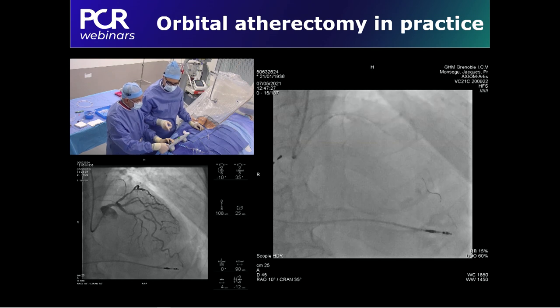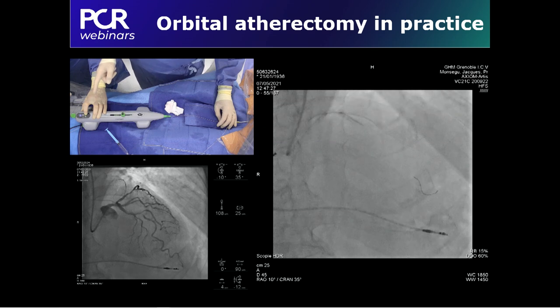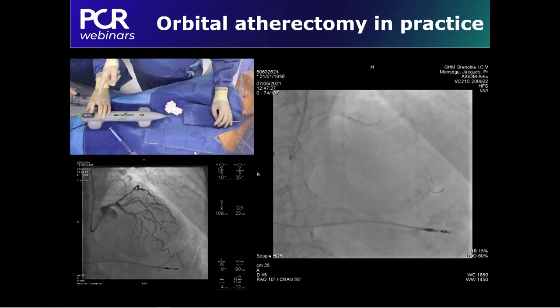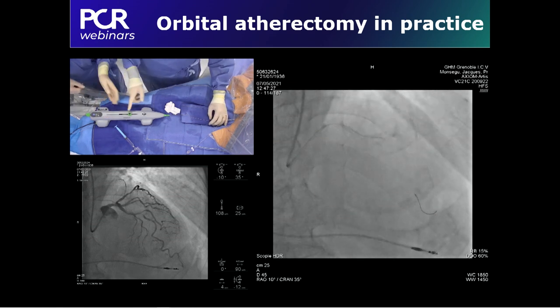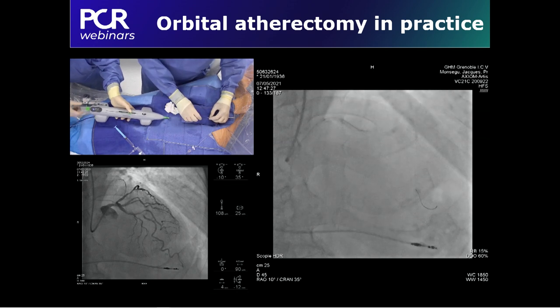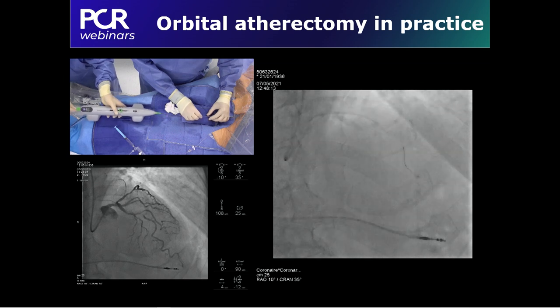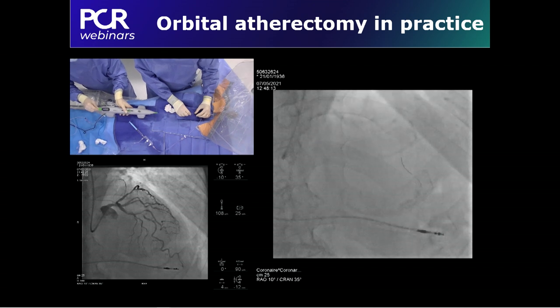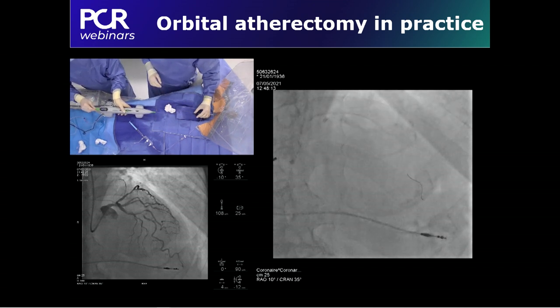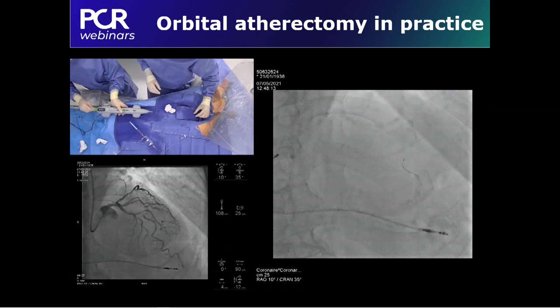Then Jacques is going to release the brake and also do a long press on the low speed button until it blinks. And as soon as it's blinking, everything is ready to pull back the device. So push the button, the knob. Okay, so absolutely no sound.